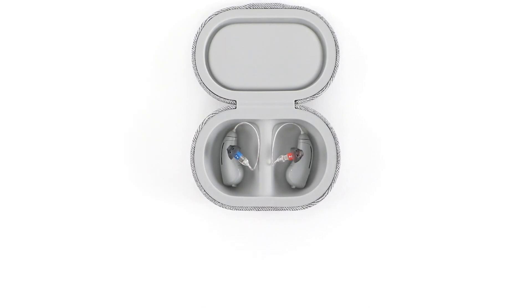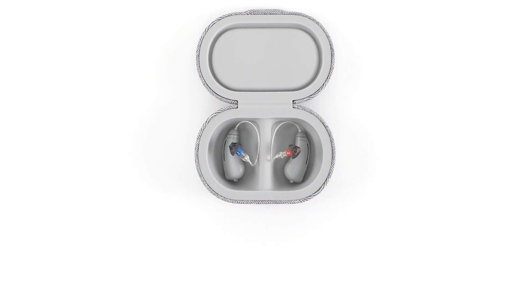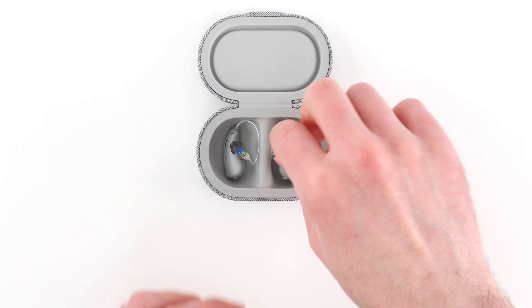Next, you'll need to power on the hearing aids. Even if you only plan to use one hearing aid, you'll need to power them both on to get set up.